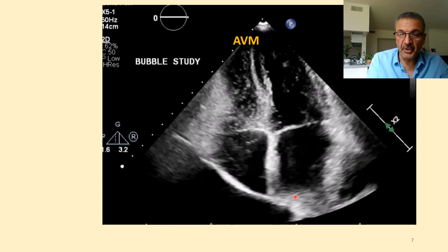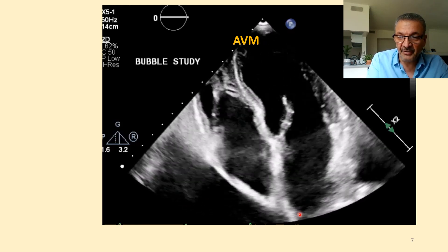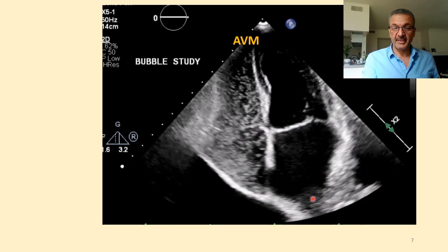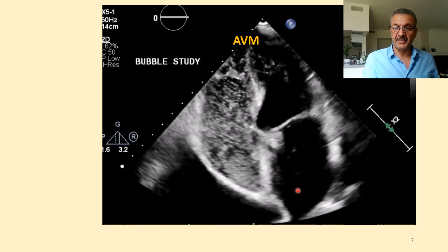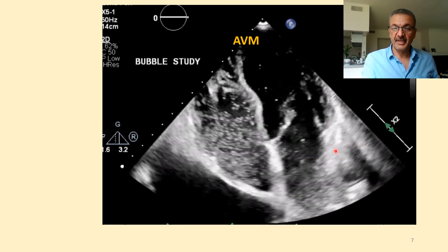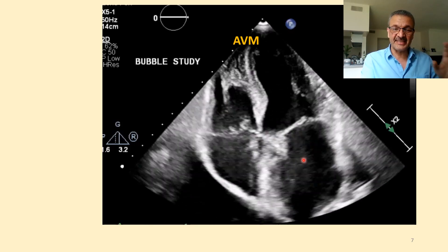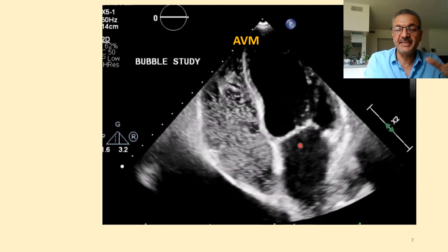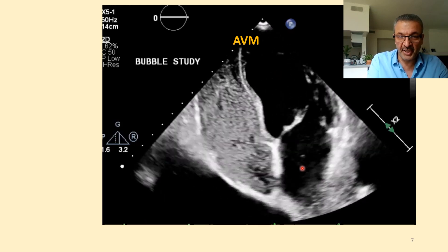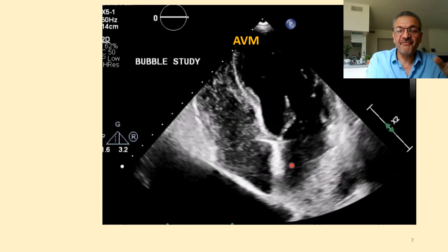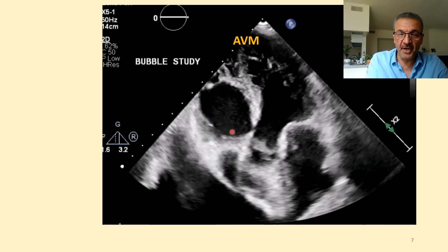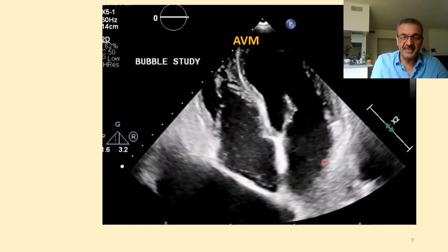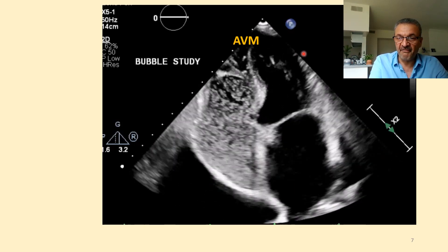How can we diagnose AV malformation with bubble test? There are two criteria. First, macrobubbles can be seen entering the left atrium through the pulmonary vein — starting from the pulmonary vein and going up, not from the interatrial septum. But it is very tricky to detect the origin. The most important criterion is timing: in AV malformation, macrobubbles show up after five beats of bubble appearance in the right side before they show up in the left side. If either of these criteria is present, we can say the patient has AV malformation.